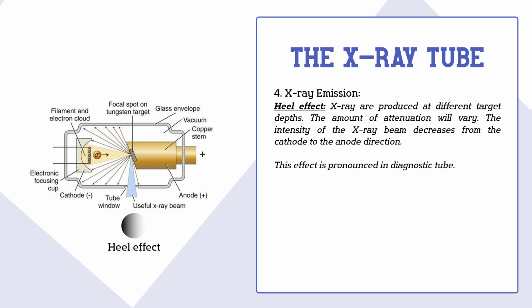This effect is pronounced in the diagnostic tubes due to low X-ray energy and steep target angle. The Heel effect can be minimized by using a compensating filter.